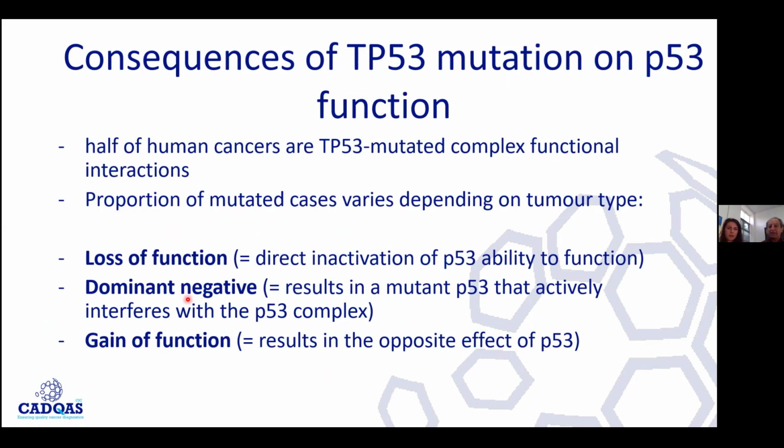So we were discussing how to recognize the mutant pattern, but we cannot tell from the staining what the effect on the cell is, what kind of function could be lost. This could be important. I mean, we use IHC, and we will show you some examples for diagnosis and prognosis, especially for molecular classification.